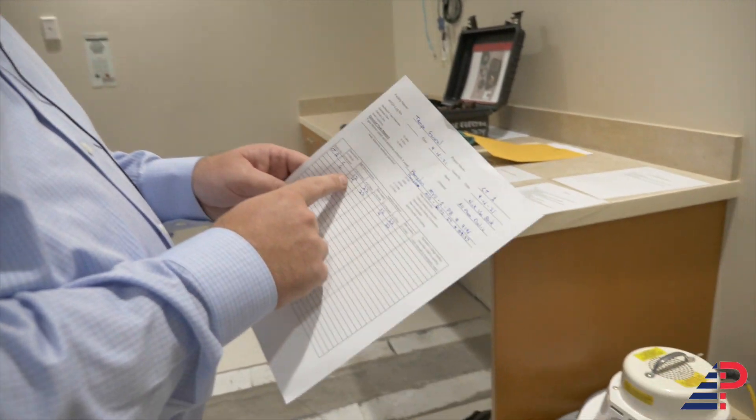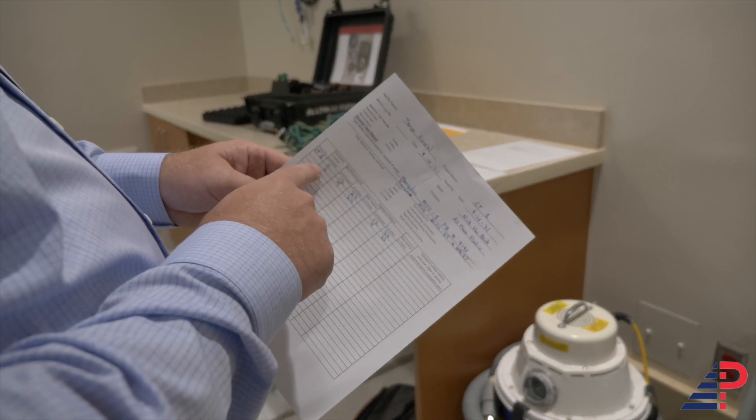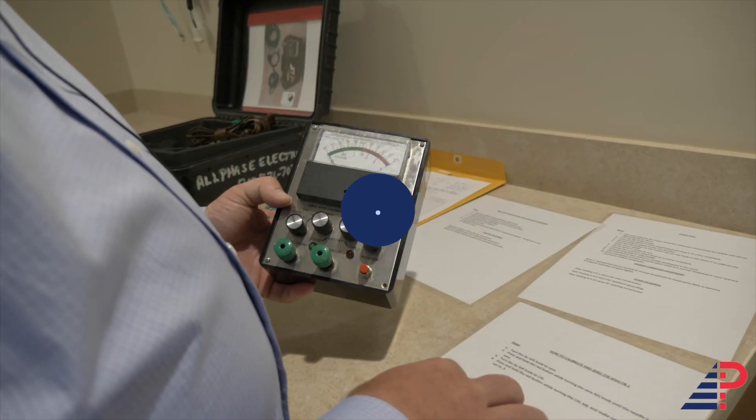In this room we have 12 critical receptacles, 4 general receptacles, and 22 others. We'll do our reading in millivolts first and then another reading in ohms. When you're testing, just use the highest number you got from each reading — that's the number you put down on your sheet for your maximum millivolts and ohms.